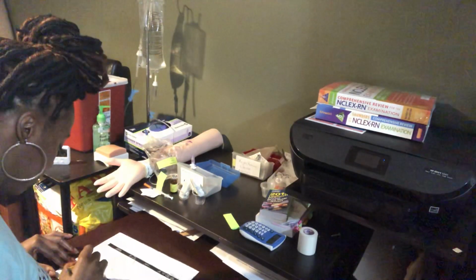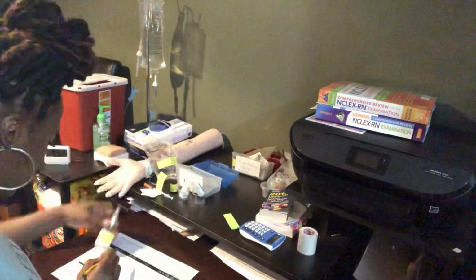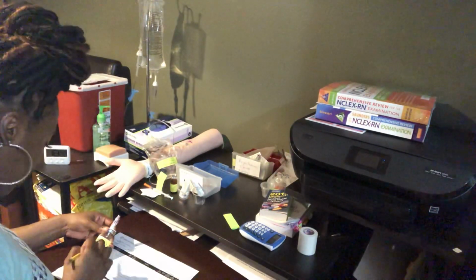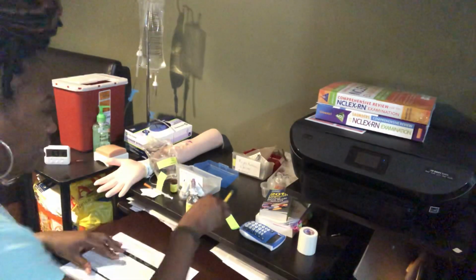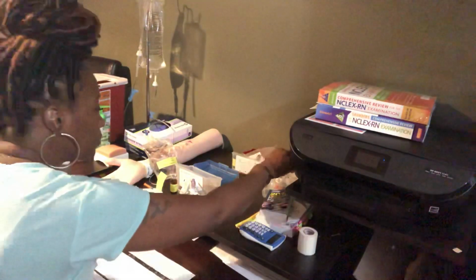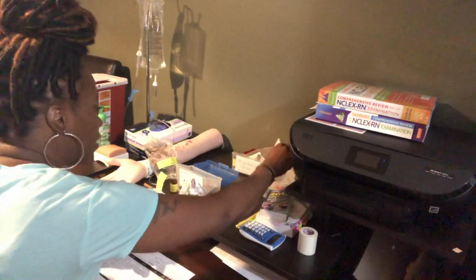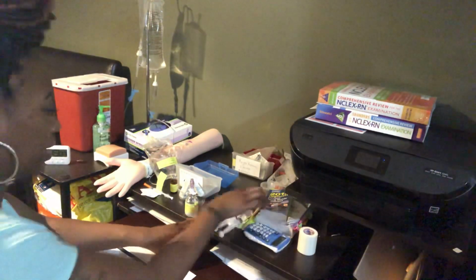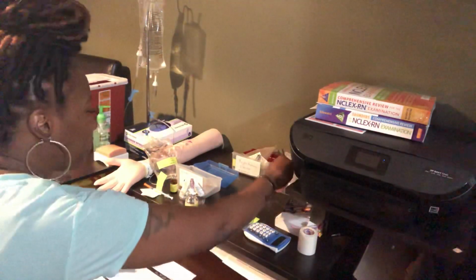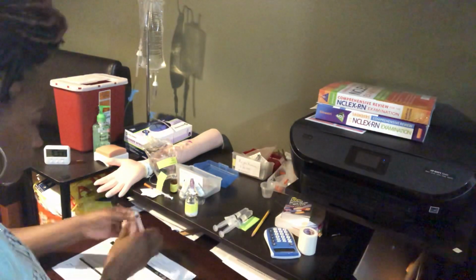80, yeah, but it's only 80 milligrams available, so that's what I'm looking for. Lasix 80 milligrams. So what I need for that, I have to get normal saline, and I know I need an alcohol prep for each one. And then I also have to get my thingy to get. I need an alcohol wipe to wipe the port.